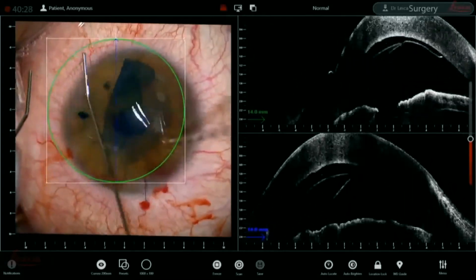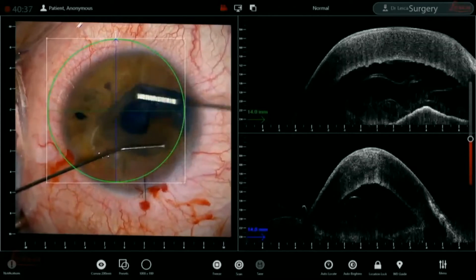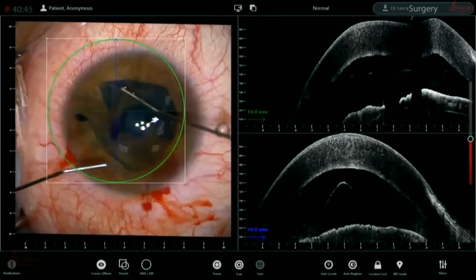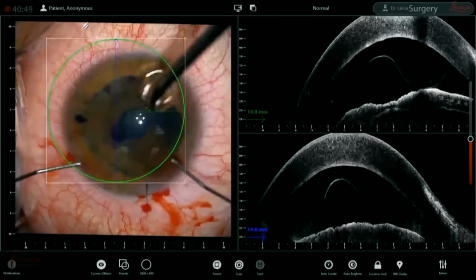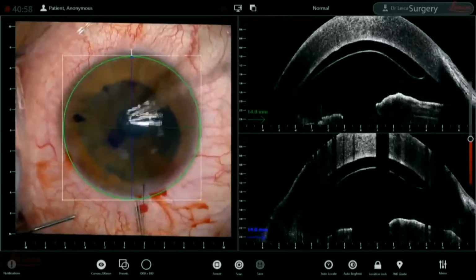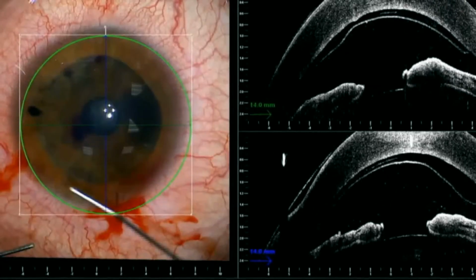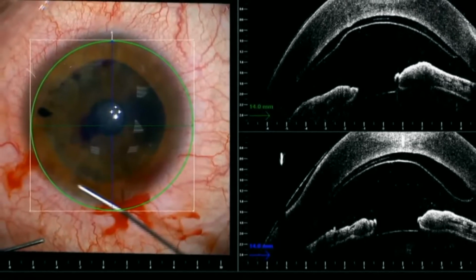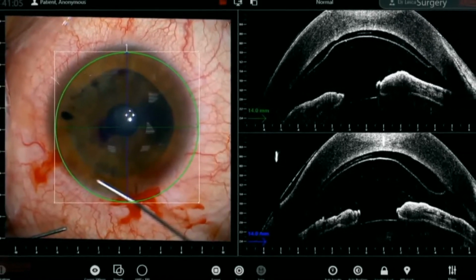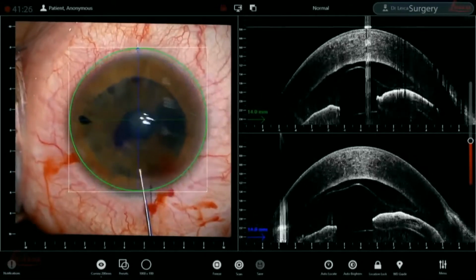So I'm just unfolding the graft, and once the graft is completely unfolded, and it sometimes takes a few strokes before the graft is totally unfolded, I'm still checking the correct coiling of the graft right until the very end. And here I can see that I unfolded the graft, but I'm still seeing the edges of the graft coiling inward, in the correct position, right side up.